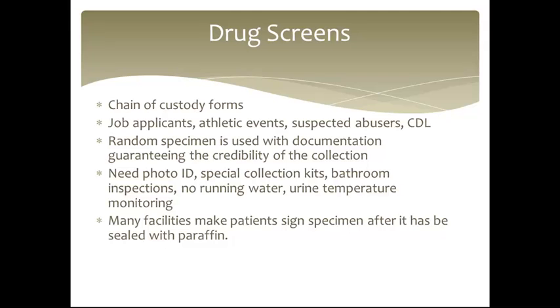Many facilities make patients sign specimens after being sealed with paraffin. Paraffin is what we use to seal the tops of them. A lot of times with drug screens for suspected abusers, many physicians will only give them a certain period of time to go give a urine sample. So time is really important to record on these, because some suspected abusers will wait until they absolutely have to go in and give a urine sample.